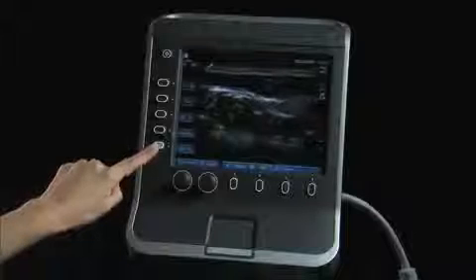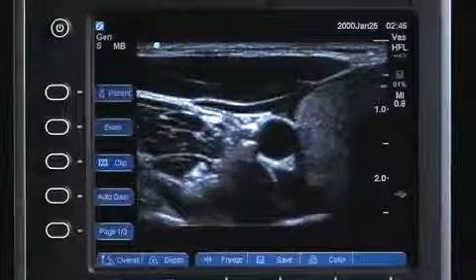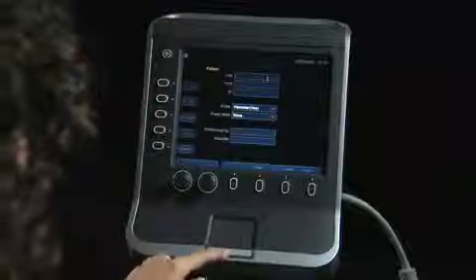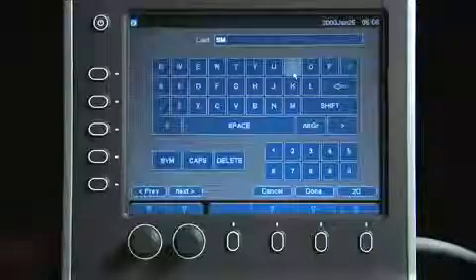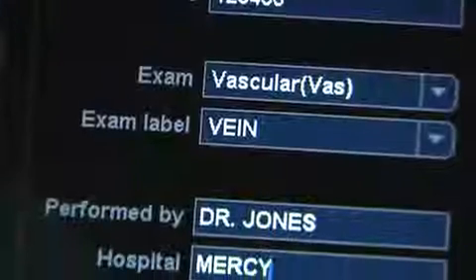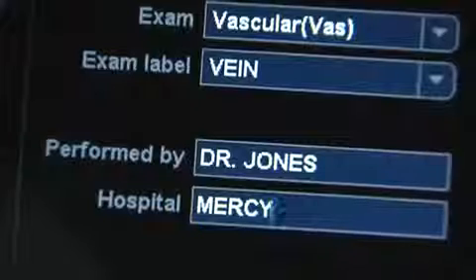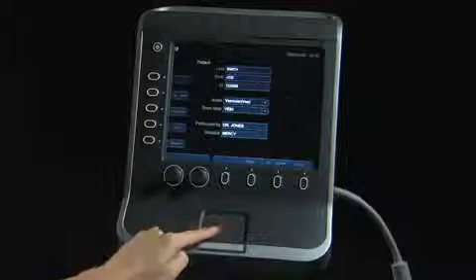In the secondary controls, page numbers are indicated at the bottom of the screen. Select the page key to activate the next page of controls. On the first page of the secondary controls, the patient key allows exam information to be entered into the system, including patient demographics. This screen is also used to select the exam type, the exam label, and provide data regarding who performed the examination and the institution where it was performed. Information entered here will be displayed on the image display screen.